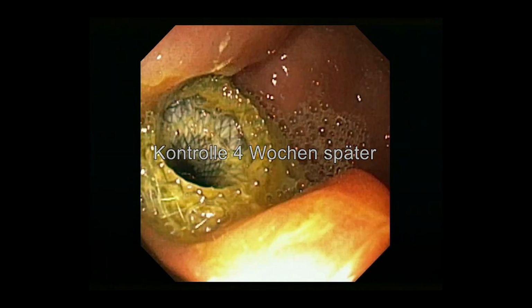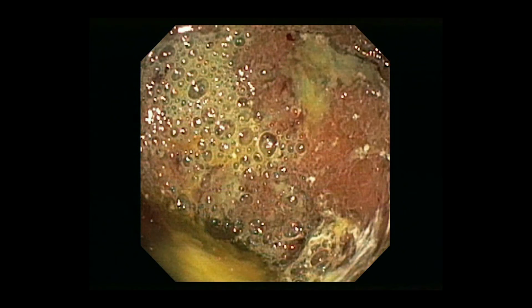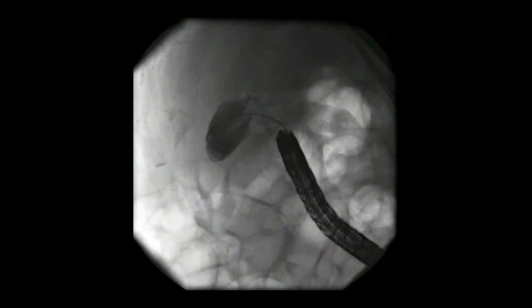The patient made a rapid recovery during the subsequent course, with inflammation parameters normalizing, and it was possible to discharge him after 5 days. A follow-up endoscopy with contrast administration after 4 weeks showed that the AXIOS stent was correctly positioned, with no intra-abdominal contrast leakage and with inflammation-free bile duct epithelium. During the same visit, the biliary plastic stents were also exchanged for a metal stent to provide stable palliative drainage.